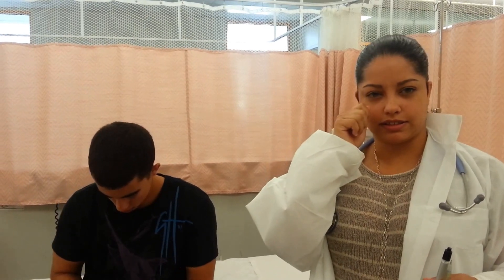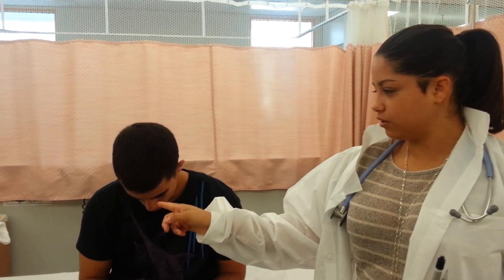After that we're going to go into the dark room and we're going to do the red reflex, which is taking the ophthalmoscope and flashing the light into the pupil until we can see the red reflex, which is the retina. Once we see it, we're going to go slowly forward — I'll use my right eye to examine his right eye so we're not face to face — and slowly move forward until I can actually see the back of the retina and the small blood vessels. And that's it.